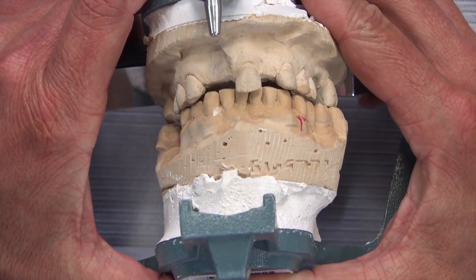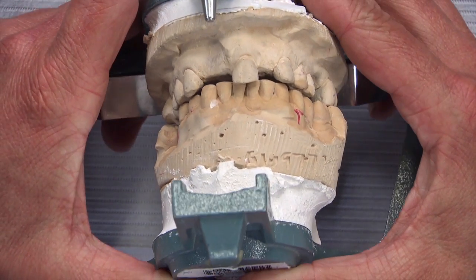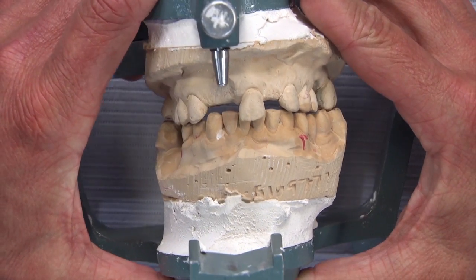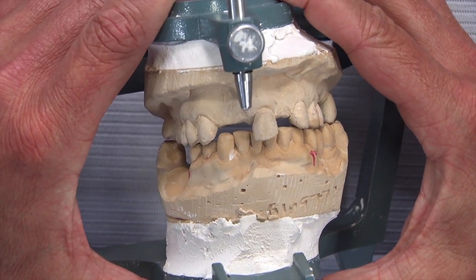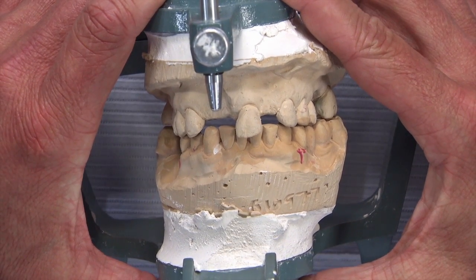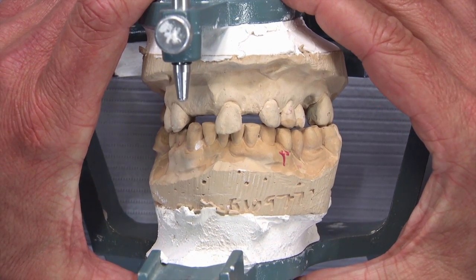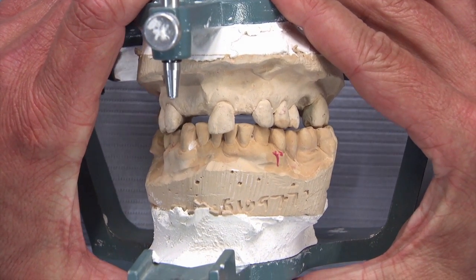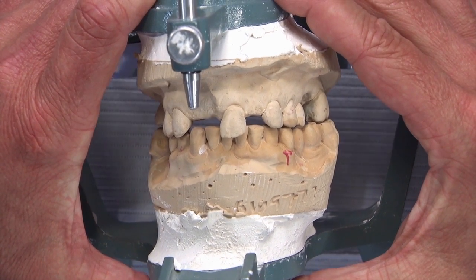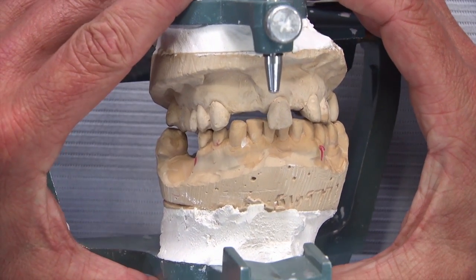This case certainly presents some challenges relative to setting up teeth 7, 8, and 10. We want to put something in there that's going to stand the test of time, function well, and not fall apart. We've got a really tight bite here — no room for mesh, relief under the mesh, a denture tooth, and acrylic. We're even limited in placing a metal pad with a post centered in the middle for denture teeth.